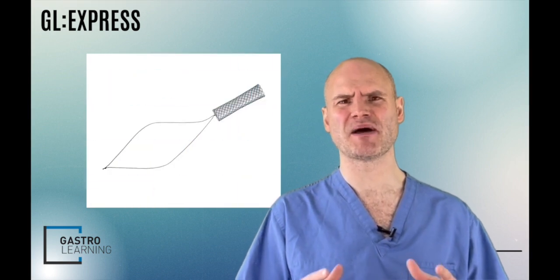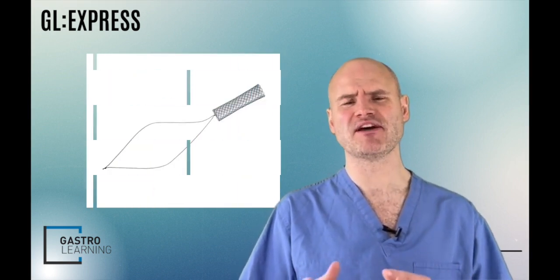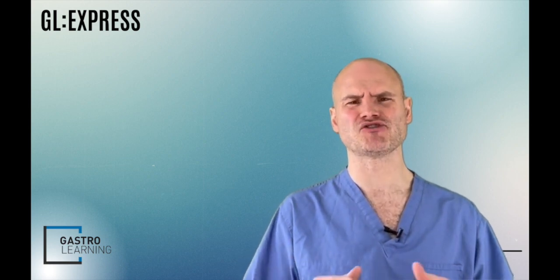ERCP. So, to combat this issue, an intraductal fully covered self-expanding metal stent was developed by Taewoong, and it aims to prevent stent migration and pancreatitis due to its shorter length and complete intraductal insertion. It can easily be removed using an extraction string. This paper reports on a study to determine the performance of this new stent versus the multiple plastic stents in the context of anastomotic strictures post-liver transplant.